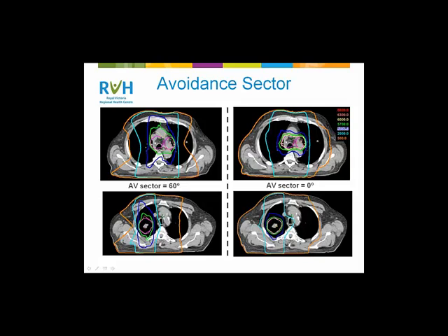If you optimized on a patient by patient basis, you'd probably have a lot of situations where 6 MV would be better than 18 MV and vice versa. We've tried to template and standardize this as much as possible for speed. There may be situations where we use some 18 MV and we could have got a little bit more dose around the periphery with 6 MV, but we just haven't taken the time to look at it during planning, to be frank.